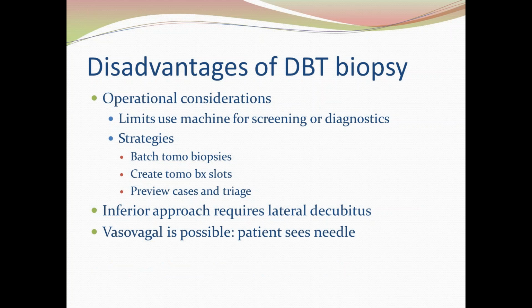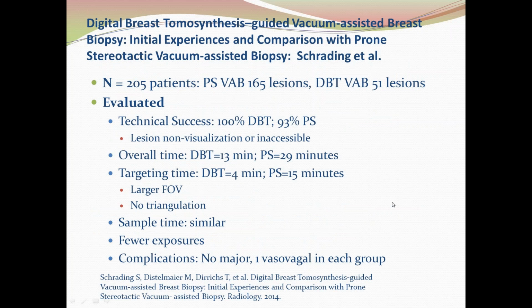Since they can see it, we have noticed a slightly increased incidence of vasovagal reaction, but it's really much less than you might anticipate. Now, the literature on this is pretty scant, actually. This is a paper that was published by Dr. Christiana Kuhl's group out of Germany. It was published in Radiology in 2014.